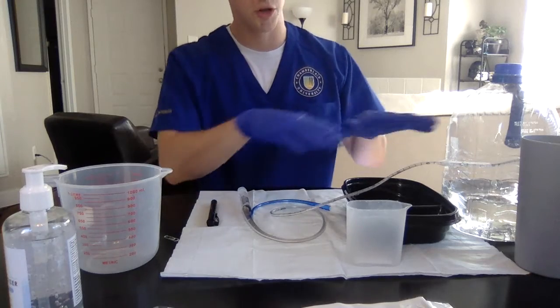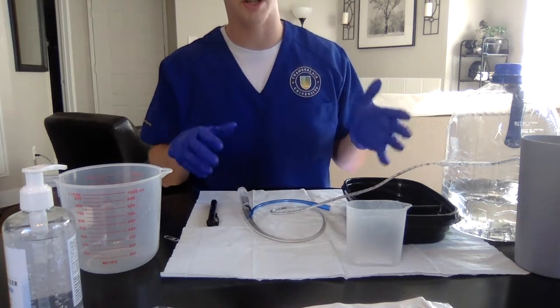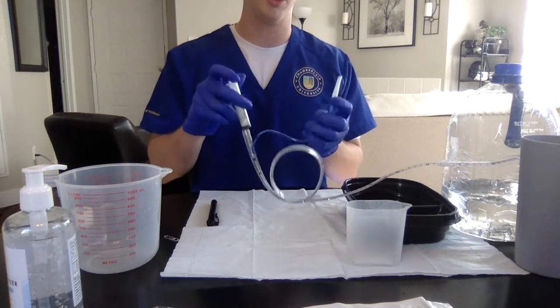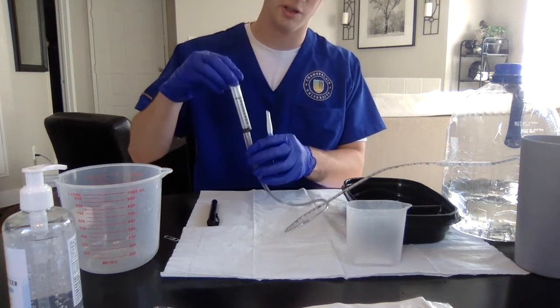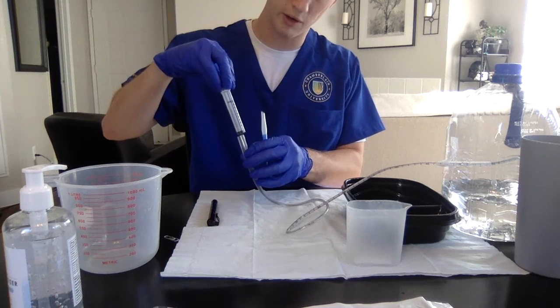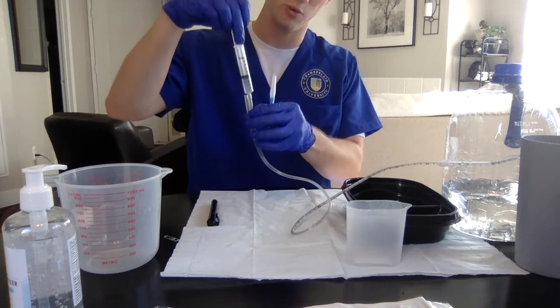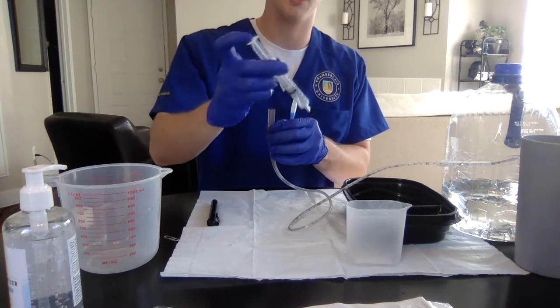So we've already checked, made sure it wasn't wrapped around or anything. We could also take bowel sounds and lung sounds at this point again if we would like. So now we can move on to the removing of some of the gastric contents. So we're going to have our syringe here. We're going to remove around 5 mLs of gastric secretions, making sure we're holding it up like this. We're going to take it out here, and then we're going to test it on our pH paper.